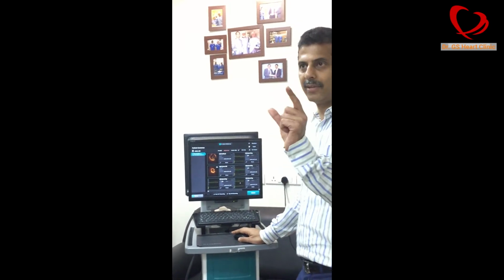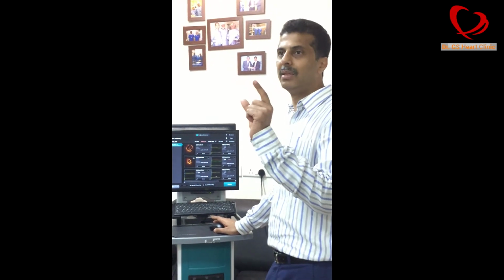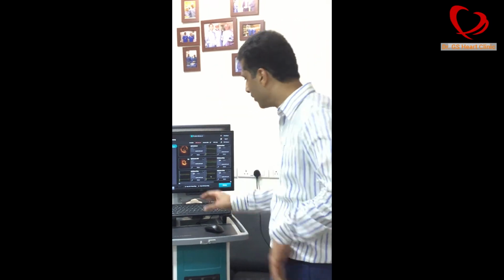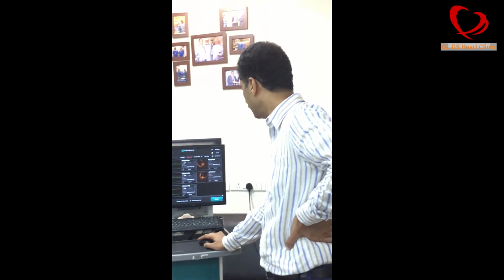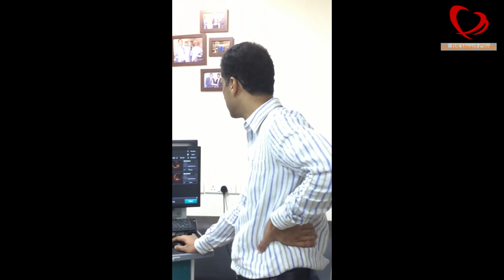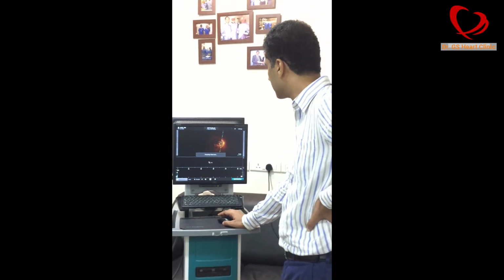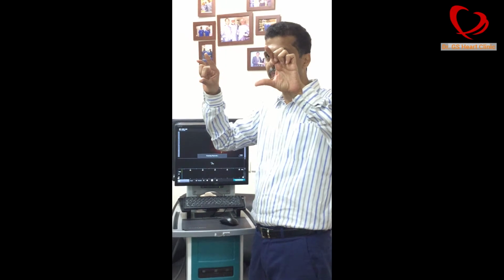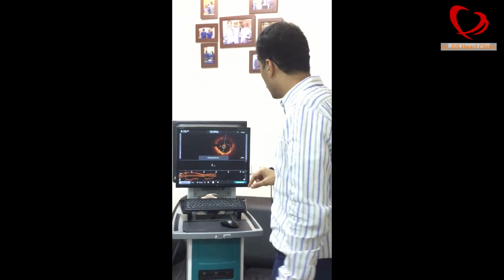So we did put one stent, which is a 4 by 28 millimeter stent. We put it, we nicely postdilated. We didn't go near the edge. We did the stenting. After that we did another OCT, and this is the first OCT after the stent. So what we realized there is, the stent edges are not fully expanded. So we thought we should look at it more carefully.